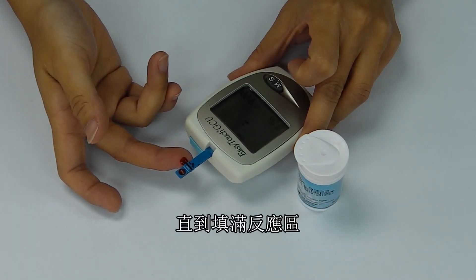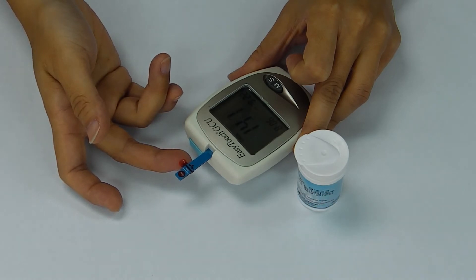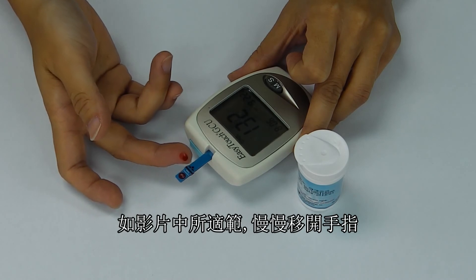Once the reaction zone is full, hold your finger in place for 20 seconds to ensure that the reaction zone is actually full. Notice that the reaction zone is completely full. Move your finger away laterally to the direction that the blood is applied, as shown here.